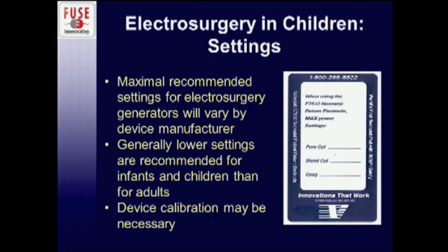Now, I actually signed up to give this talk because I wanted to answer one question for myself. Where do I set those electrosurgery settings in children by kilogram? That's one thing I've never seen written down in any pediatric surgical literature, and I wanted to figure that out. So I said, it's great, this is an opportunity for me to go out and summarize that literature and the science behind it. I went out and looked for it, and it's just not there.